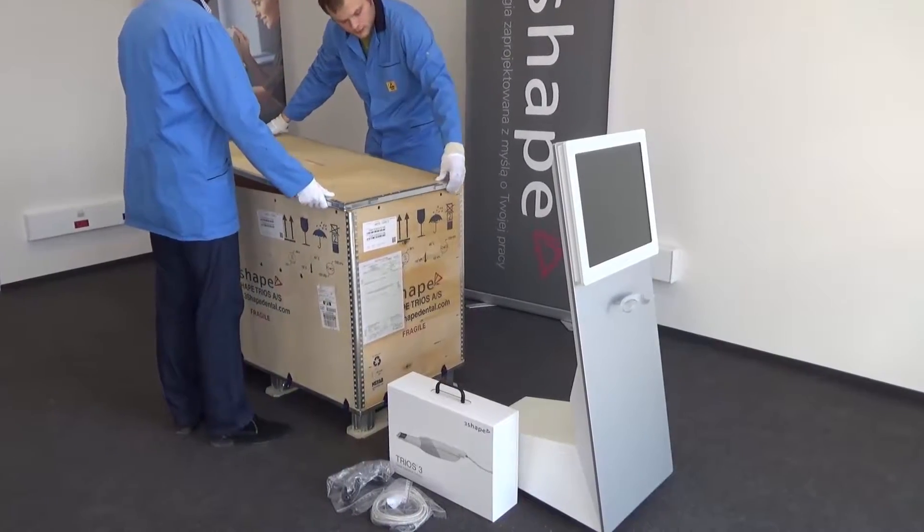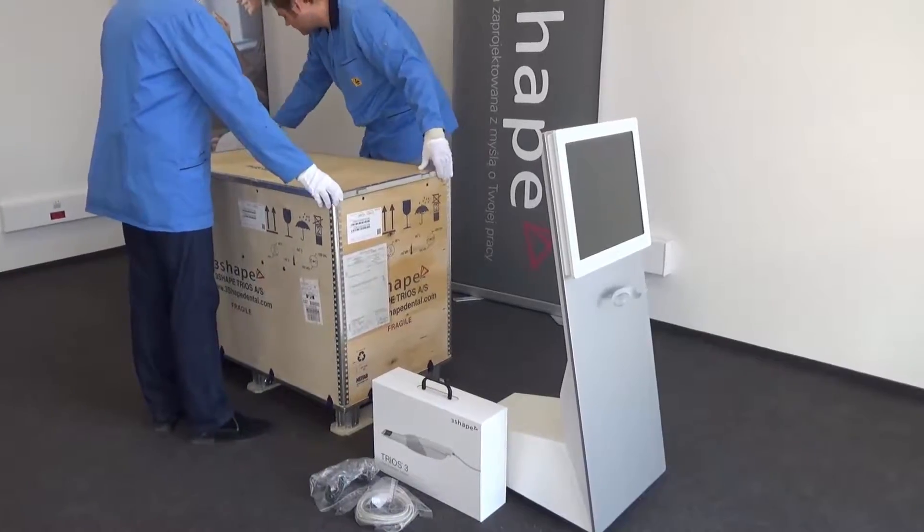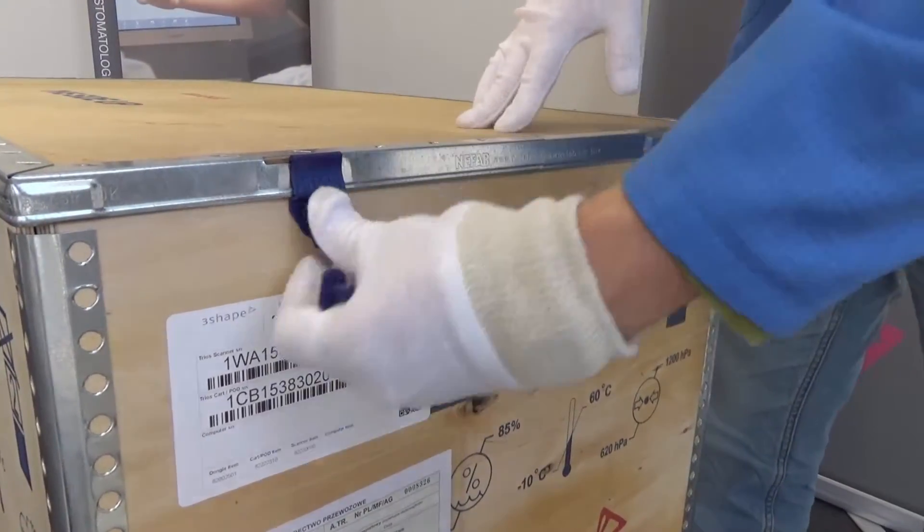Now that everything is unpacked, we recommend that you put the lid and clips back in place and store the box for future shipping if needed.